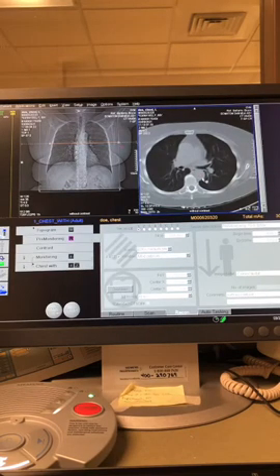We place our ROI in the descending aorta, and then we have our monitoring that's going to start. So then what we'll do is we're all set. Our scan range is set. Our monitoring is set up for our bolus tracking. And then we just start our injection and start our monitoring.